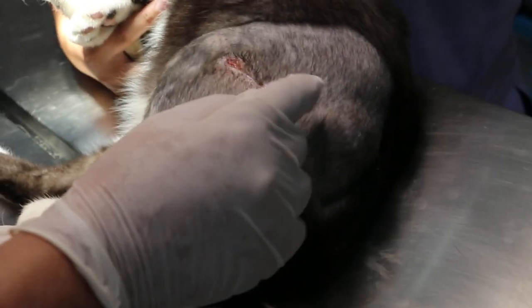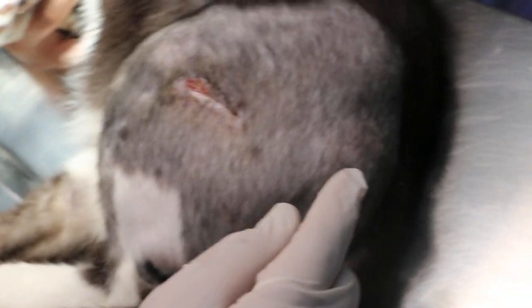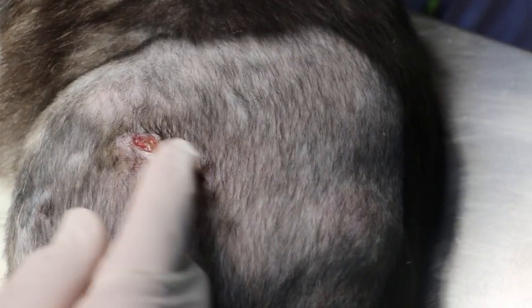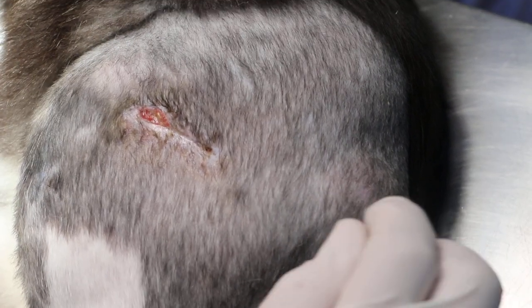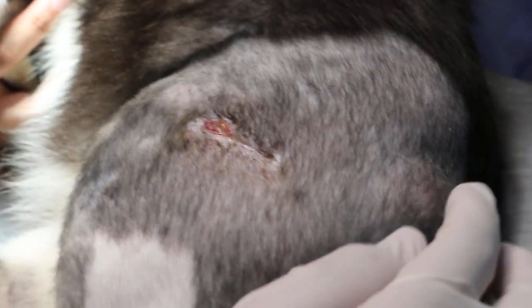After 8 weeks we will remove the pin from this part. This end of the pin is jutting out from the hip area so that after 8 weeks the two segments will heal — the bone segments will heal — and then we will just pull out the pin, because it's not good to put the pin forever inside the cat.